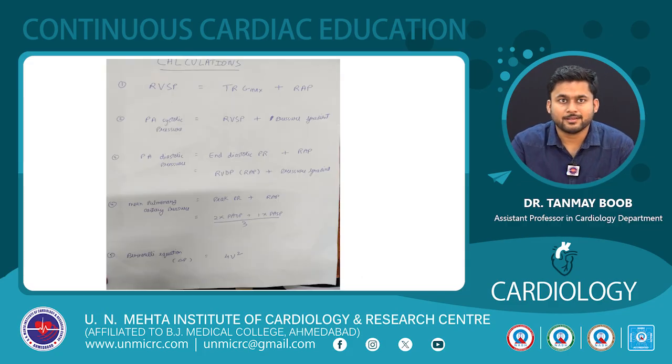This is the summary of the 5 formulas which we have to remember. Firstly, RV systolic pressure we can calculate by TR gradient max plus RA pressure. For PA systolic pressure, it is RV systolic pressure plus the pressure gradient. For calculating PA diastolic pressure and mean PA pressure, we use the pulmonary regurgitation jet. For pulmonary artery diastolic pressure, we use the end diastolic PR gradient plus the RA pressure. And for mean pulmonary artery pressure, we calculate by peak PR gradient plus RA pressure, as will be demonstrated in a further video. And Bernoulli's equation we all know, delta P is 4V square.